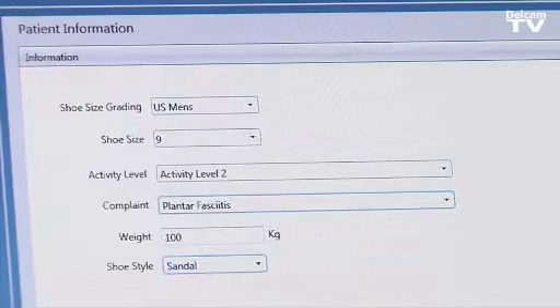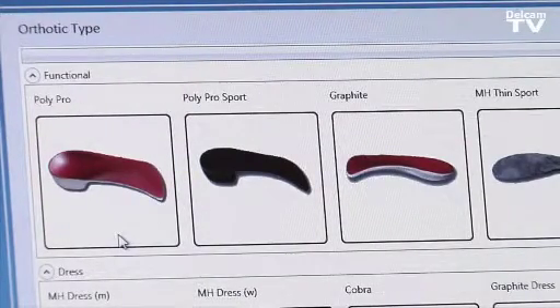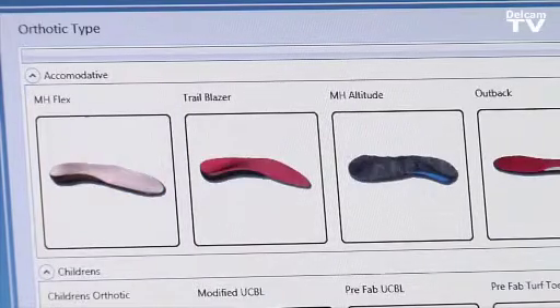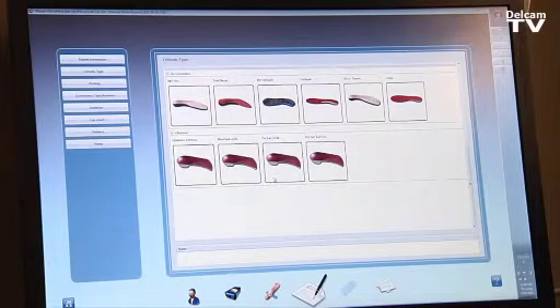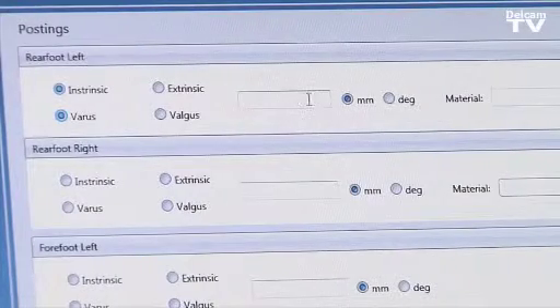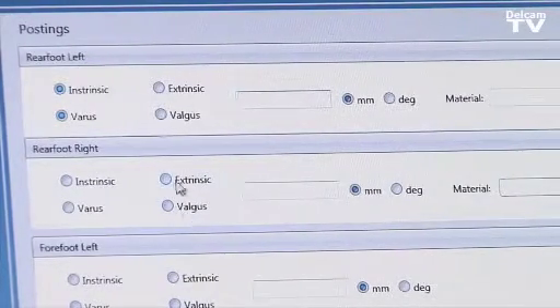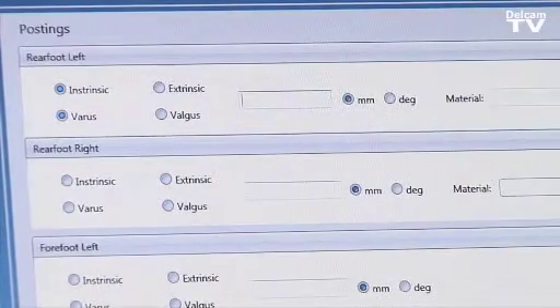We can then proceed to the next step, which covers the orthotic type such as polypropylene or graphite. As you can see, pre-loaded in the software are quite a few different orthotic types that are customizable as well. We then select the posting: the rear foot posting can be controlled independently from the forefoot posting. For example, we can add intrinsic varus and specify millimeters or degrees, and we can also add an extrinsic valgus posting on the rear foot as well.